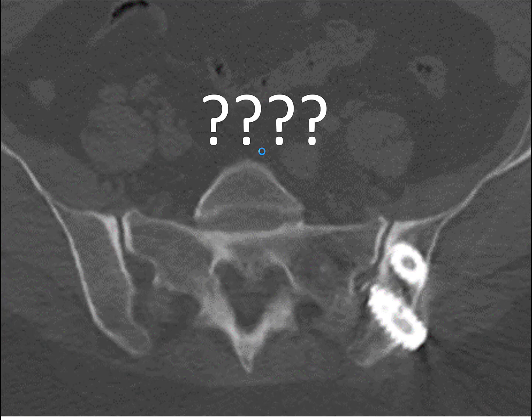What would you do? I would put her back in the CT scanner, and I would do a documented intra-articular inferior needle into that joint and give her as much as she could tolerate. Carlton used to do it for me. We would do some of them when we were trying to get the technique right here in this hospital, and put a little dye in it. You're going to see some extravasation. When you put these needles in, these patients jump, so don't put a lot of lidocaine everywhere else. You're going to change what your test is showing. Get the needle in the joint, and I think the 75% relief is crazy.